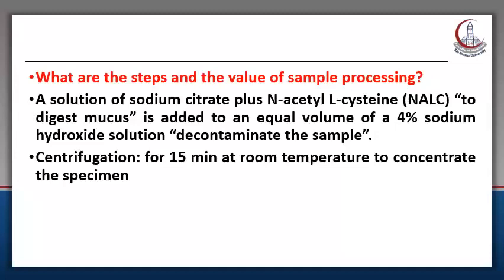The sodium citrate with N-acetyl L-cysteine liquefies the sample to facilitate concentration by centrifugation. The centrifugation is done for 15 minutes at room temperature to concentrate the sample.